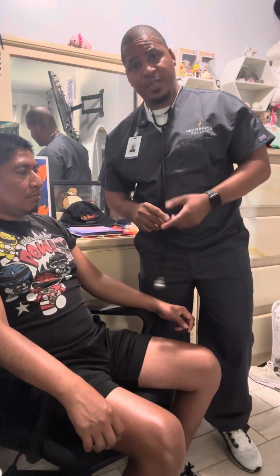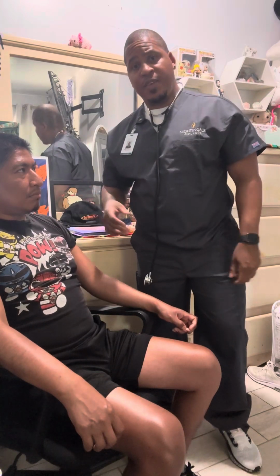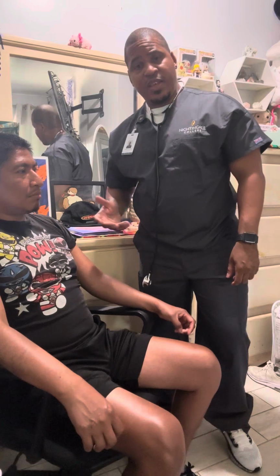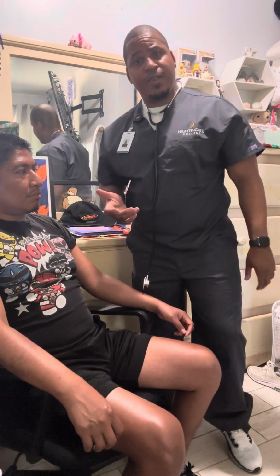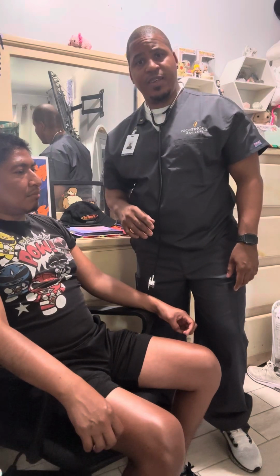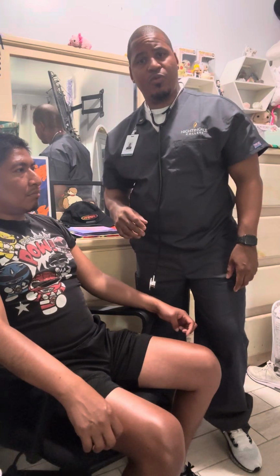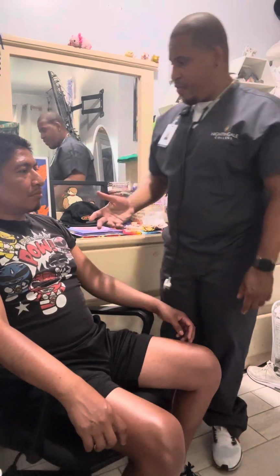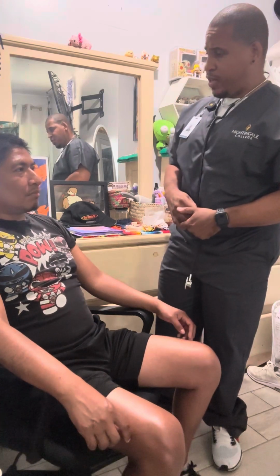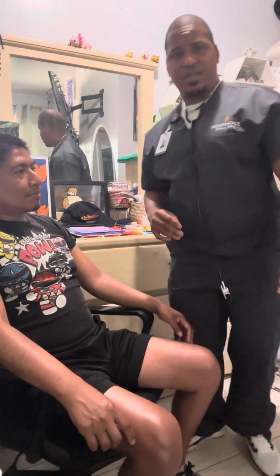The blood pressure was taken, so now I'm going to ask the patient if he has any concerns or anything else that he might want to ask me while I'm here, and then I will go ahead and document his findings into the electronic documentation record system. Do you have any other concerns or questions? No. Okay, then that concludes this vital sign session.